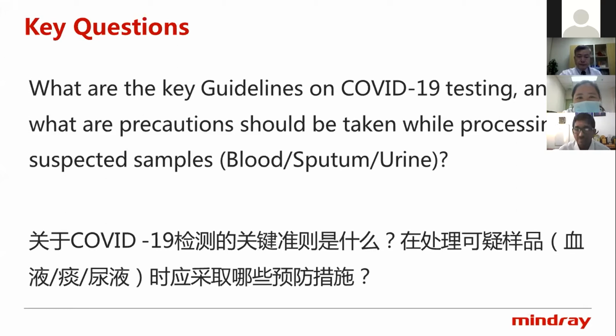let's talk about the routine test for COVID-19. It includes blood routine, urine routine, CRP, physiological chemical testing, and the PCT. These are basic clinical testing.